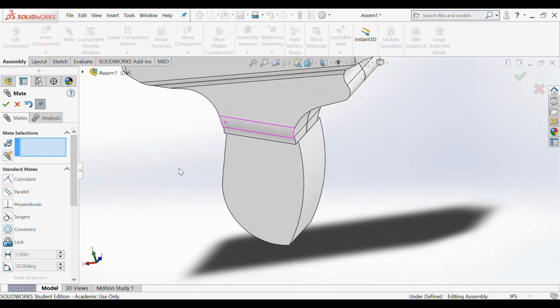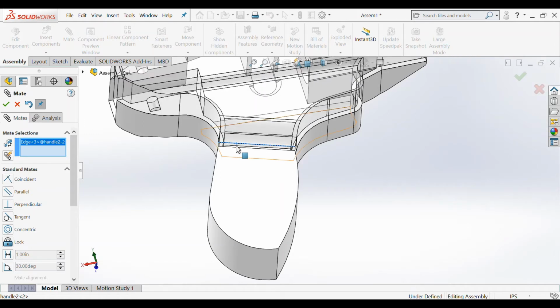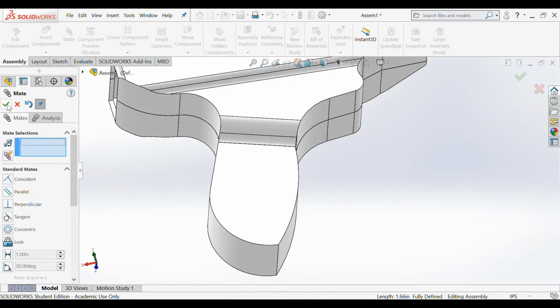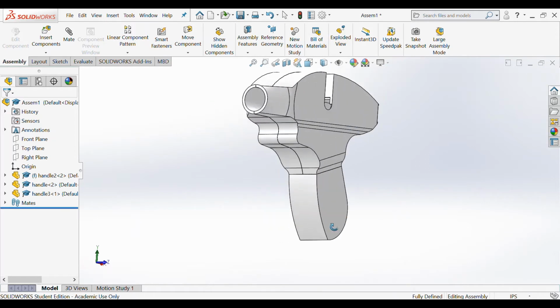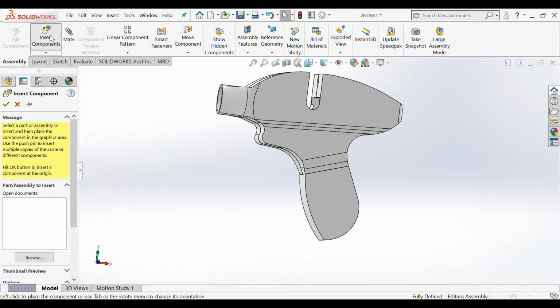And I'm going to do the same exact thing for over here to perfectly align the pieces. Make them coincident. Click on those check marks and there you go. So this is the first piece, the handle. As you can see, it is fully defined. Now we're going to go on ahead and insert our next component.